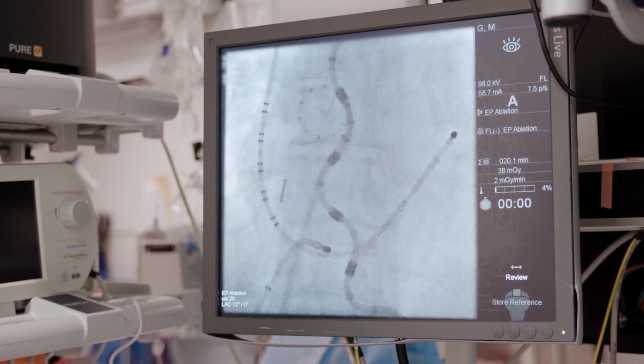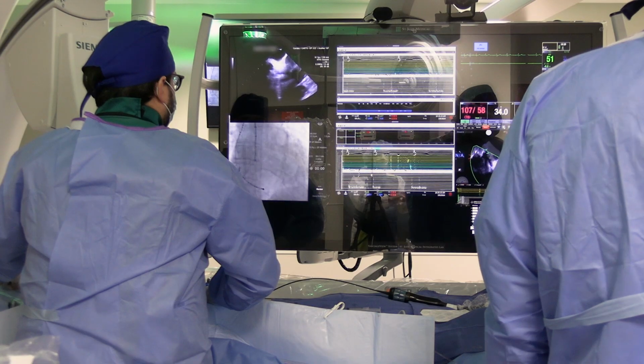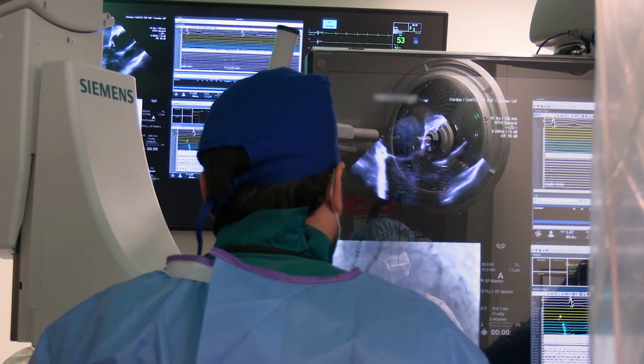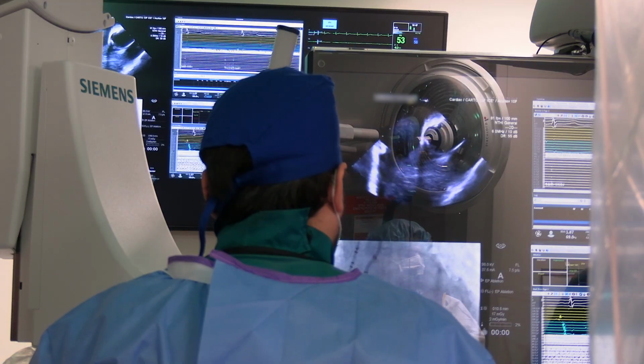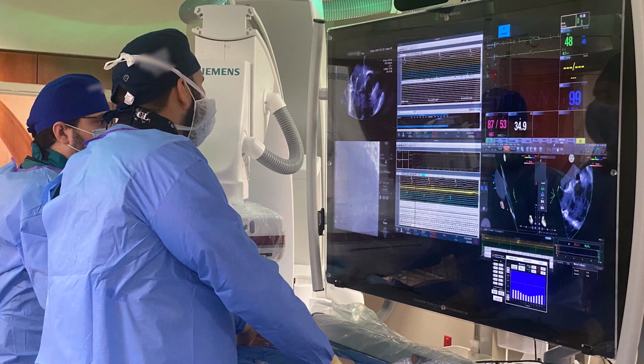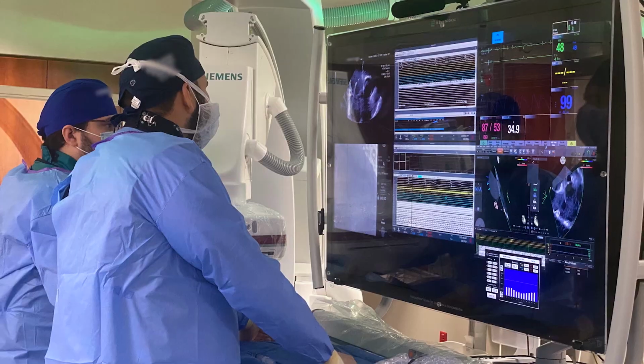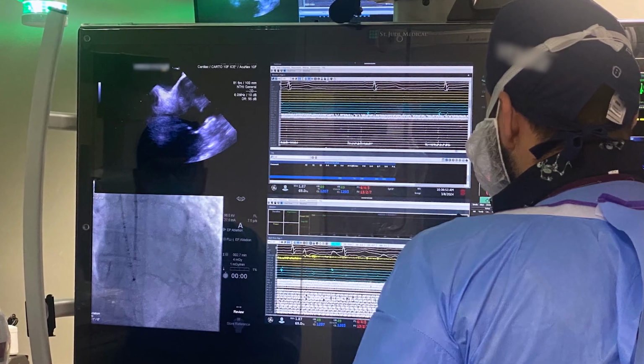My journey for going from low fluoro to zero fluoro began really 15 years ago. And it was a very personal thing for me. I mean, if you look at the reasons that cardiologists and electrophysiologists retire prematurely, the vast majority of them are because of back injuries and neck injuries. So it's basically the wear and tear on the back from the weight of the lead. And that's true. And I was one of those statistics. So I was going home basically barely able to walk some days because of back pain.